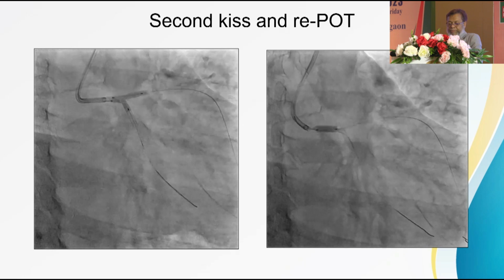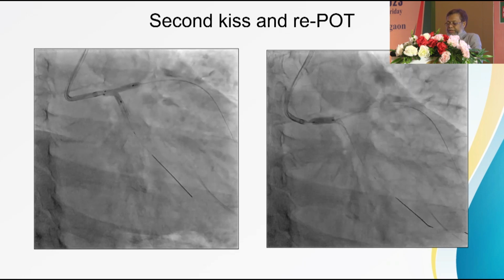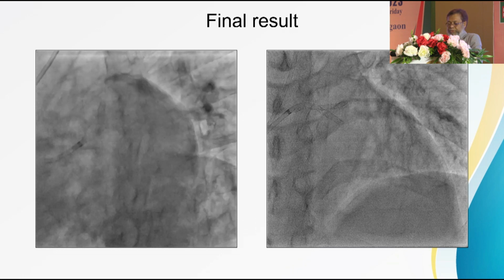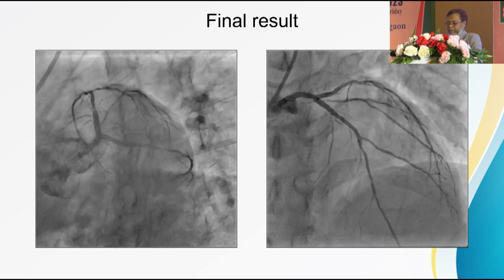Here, on the left panel, second kiss, and on the right panel, that is the final POT. And this is the final result.